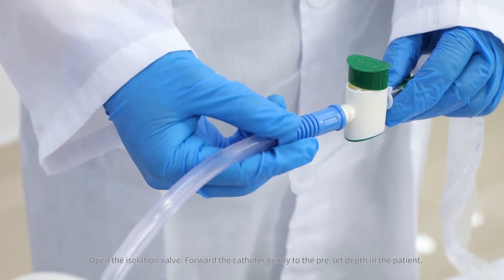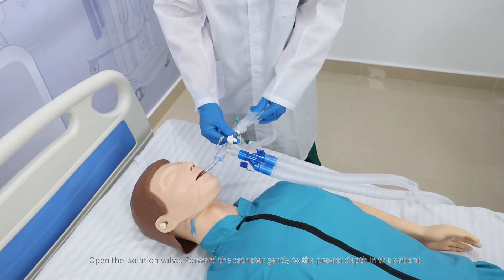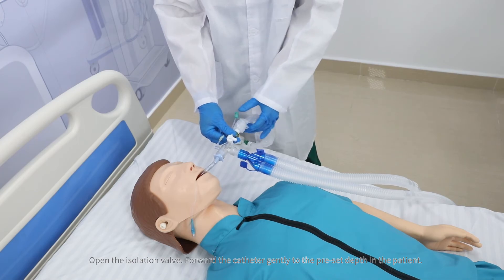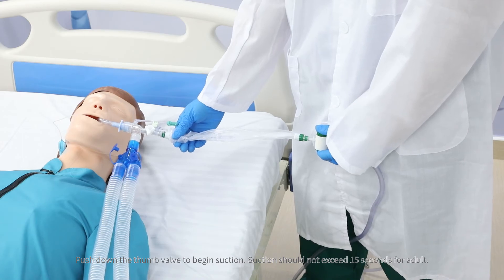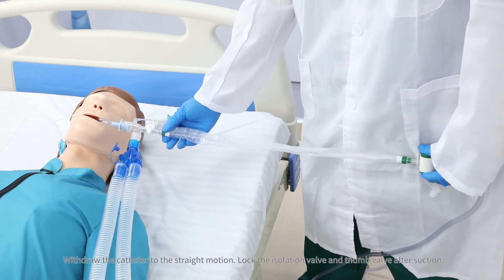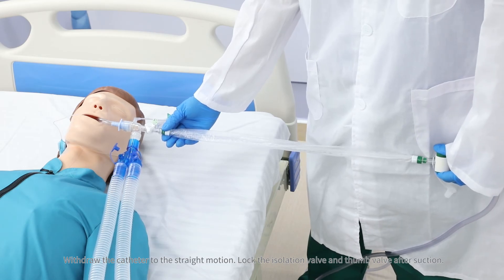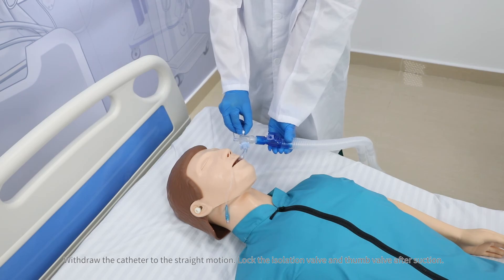Open the isolation valve and forward the catheter gently to the preset depth in the patient. Push down the thumb valve to begin suction. Suction should not exceed 15 seconds for adults. Withdraw the catheter with a steady motion, then lock the isolation valve and thumb valve after suction.